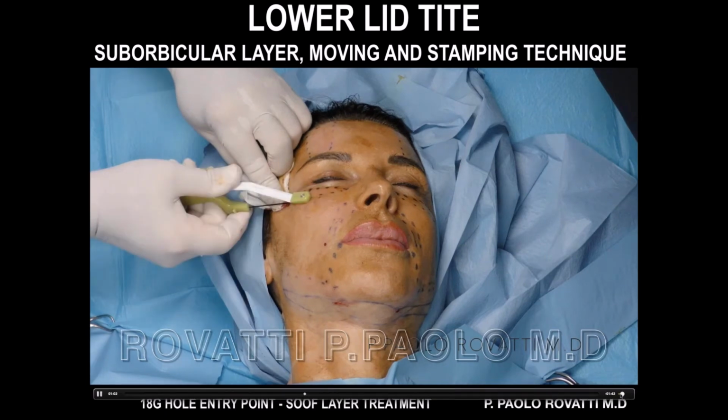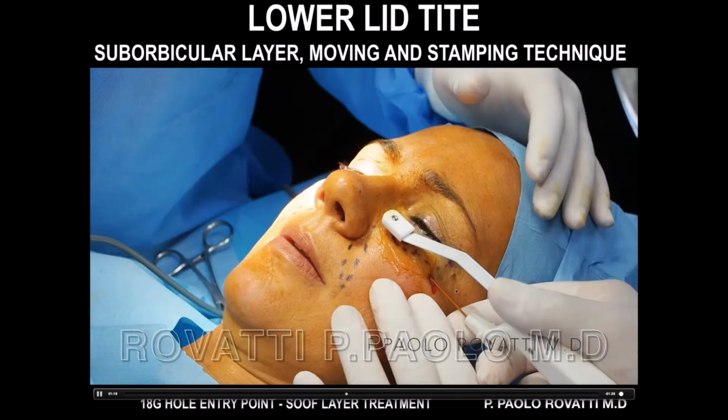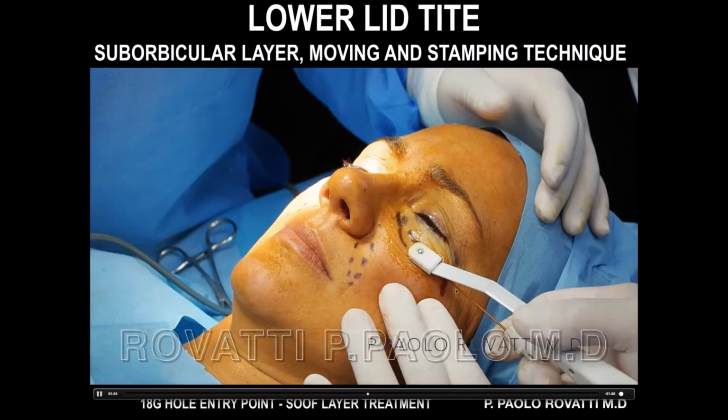When I'm doing the submuscular, suborbicularis layer, I'm going backward slowly, but I'm going backward. I don't stop. Look, this is going backward. I hope you don't see stopping, but you see slowing, because maybe it's the internet connection, I don't know. And this is very high resolution, but I prefer you see it.